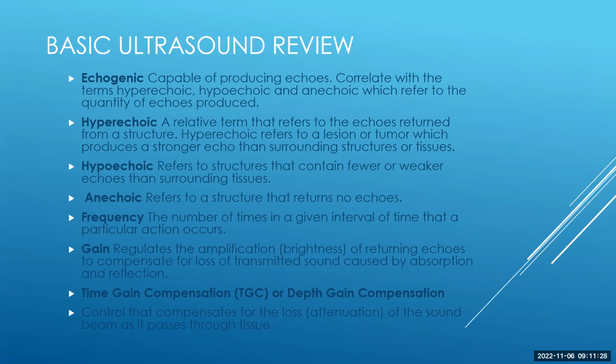Basically that's to compensate for the loss of transmitted sound caused by absorption or reflection. If you go in the sonographer world, ultrasound technicians and radiology type folks, they really have their gain turned down a little bit, so it'll be a darker image. I'm kind of in that camp. Not that I was previously a sonographer before becoming a nurse anesthetist, but the idea is I like to really enhance the surrounding anatomical features, and that really helps me fill in that anatomical puzzle.